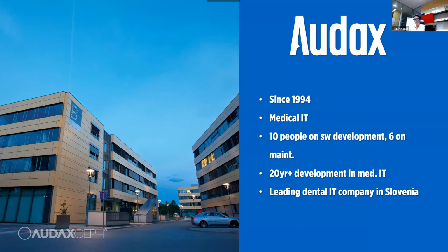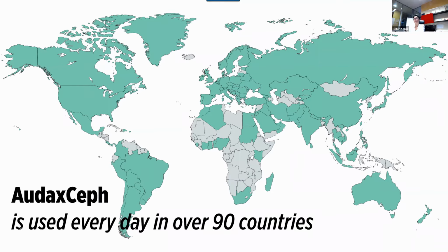We develop our own patient management software, which is used widely in Slovenia, but we also put a lot of energy into developing clinical applications such as AudaxCeph software. AudaxCeph software is sold worldwide. We have clients in over 90 countries. Actually, from last week it's 91, because we have a client in Azerbaijan now. You can imagine that if we have clients all over the world, we really do need to offer superior technical support to our clients, and we do that. I will talk about that a little bit later.